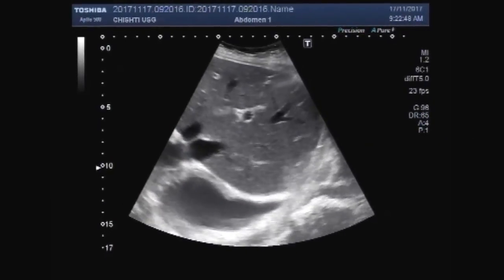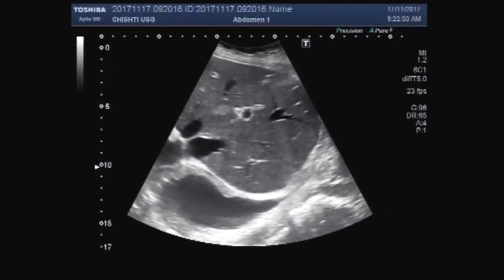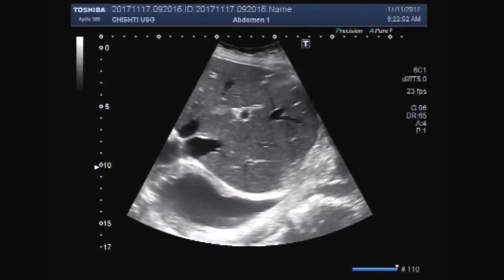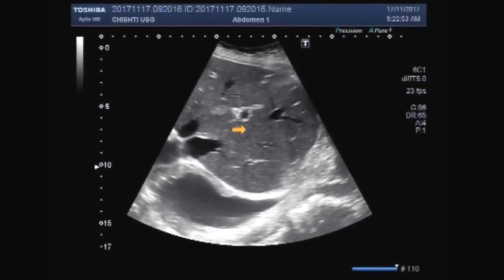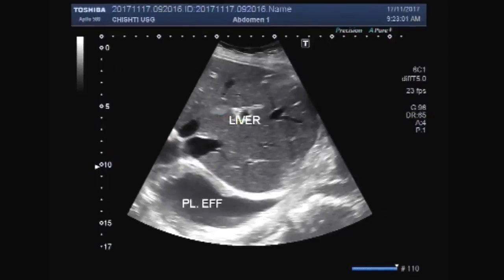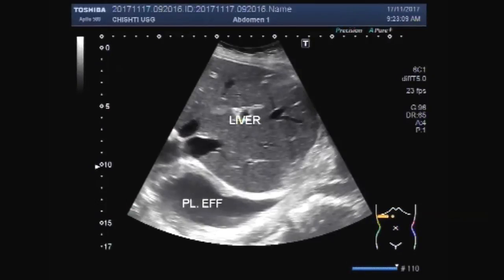Now you can see the pleural effusion — the fluid in the pleural cavity. This is the liver. There is a significant amount of fluid seen in the pleural cavity.